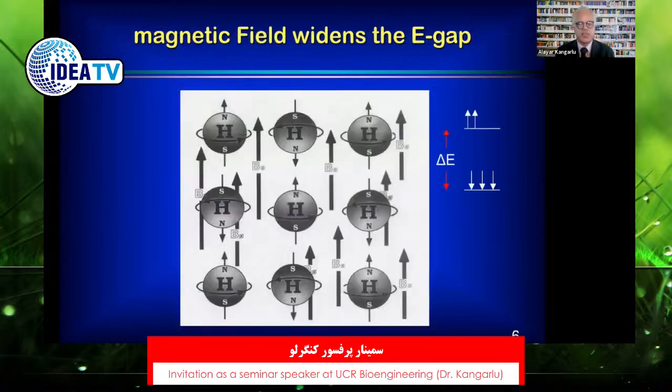But once they take you from where you are and put you inside a strong magnetic field, here B0 represents the magnetic field, these protons will line up.